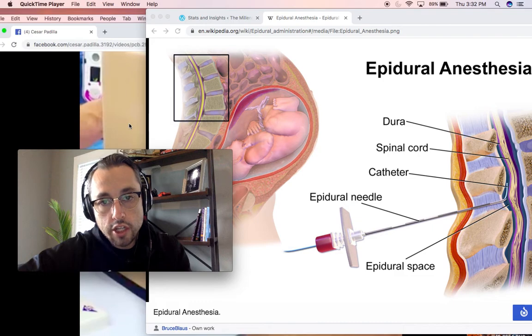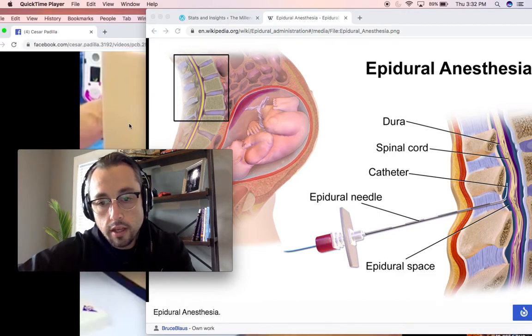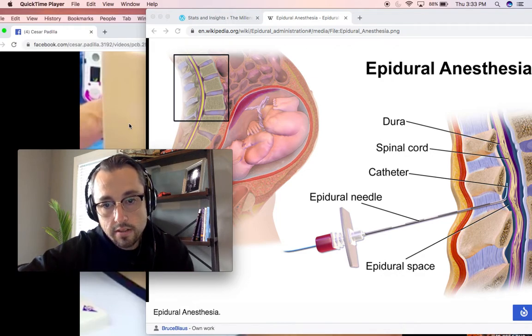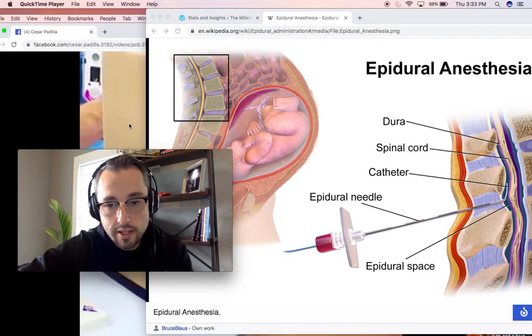It's more of just an educational video: how the epidural is done, and what the anatomy behind it is. I'm certainly not going into the types of medications we use or any other aspect of the epidural. You can spend hours and hours on this. This is just a procedure to show you, for those of you that are medical students, there's a lot of implications here with anatomy. You all learn anatomy. For those of you that are residents, it's hard to understand a new procedure without seeing it.